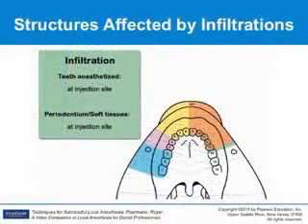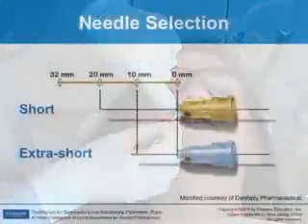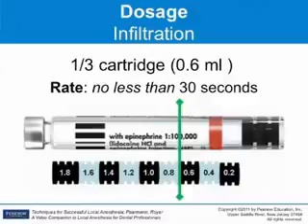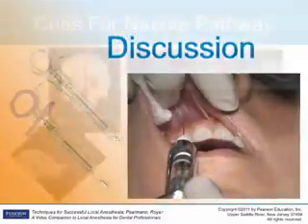Every injection demonstrated follows a step-by-step approach to injection techniques. Each area of an injection is described, starting with the nerves, tissue, and teeth affected by specific injections, and ending with a discussion reviewing possible complications and comments.